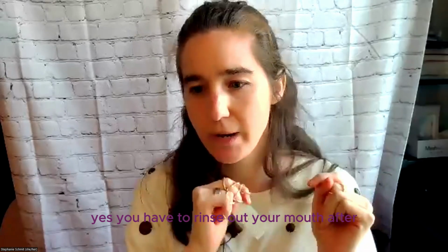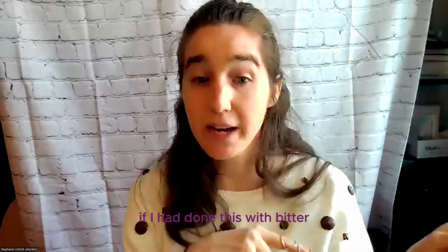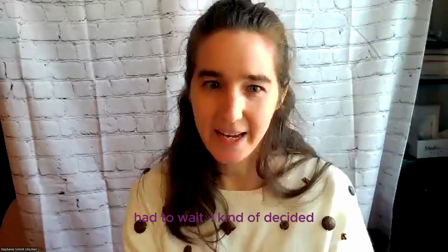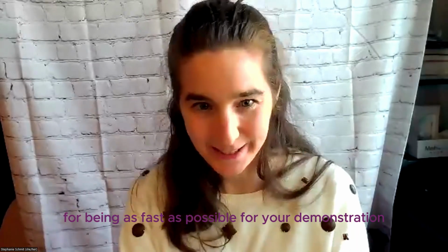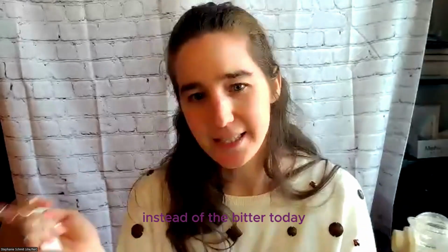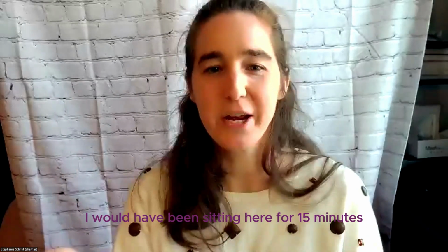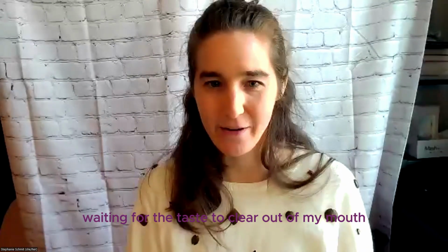Yes, you have to rinse out your mouth after each test to get rid of the taste. If I had done this with bitter, I would have definitely had to wait. I just decided, for the sake of being as fast as possible for your demonstration, I didn't wait to do that. That's another reason I chose to use the sugar instead of the bitter today, because otherwise I would have been sitting here for 15 minutes eating sour gummy worms, waiting for the taste to clear out of my mouth.